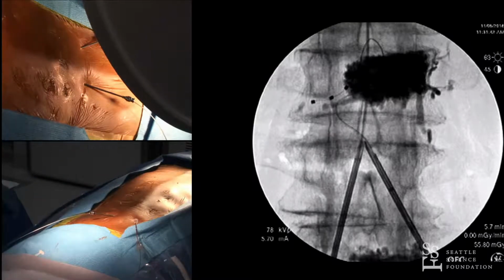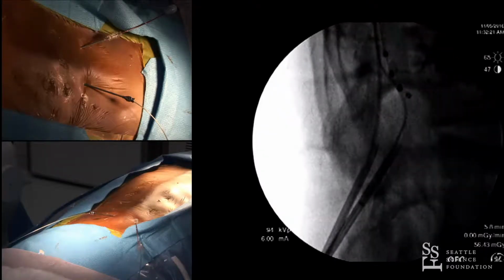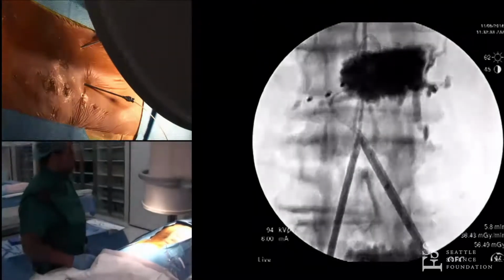And for a trial, I would solidify that in place. That contact, third contact is a little further out than I like it, but that's in essence. Let's go back to the lateral. Still over the DRG there. More of a challenge to see everything with the contrast. But yeah, in decent position. So I would certainly trial that and see how it goes. And if I get good stimulation, this would be a great position. For the permanent, I might like to have that last third contact out a little bit further.